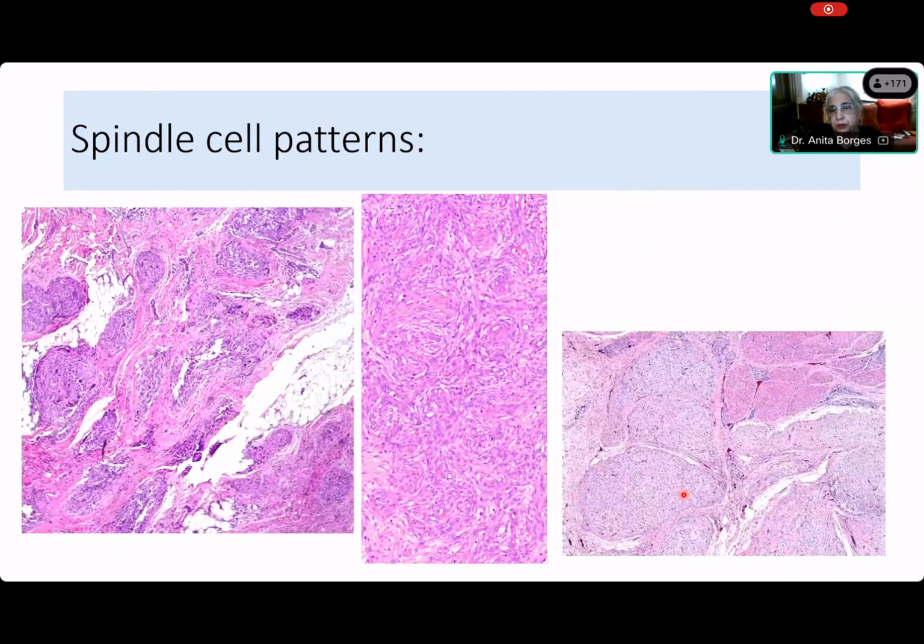Now this is the other spindle cell pattern that you should be able to recognize. These are spindle cells, and these are all running. I'm telling you they're spindle cells, but I've taken it at very low power because I want you to try and identify this pattern. Saida, what is this pattern? All these three have the same pattern. They're not all the same lesion, but they all have the same pattern. Yes, what is that pattern, Saida? The plexiform pattern. Plexiform. Excellent, Saida. That's very good. Does everybody now agree?